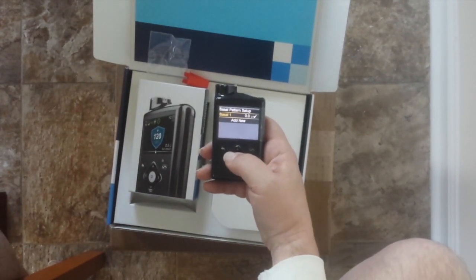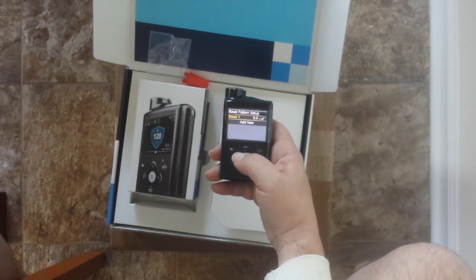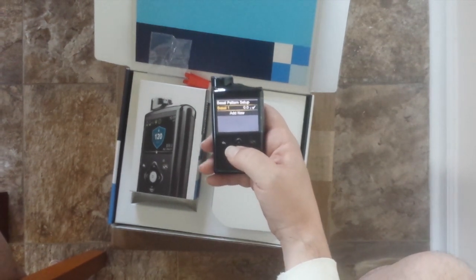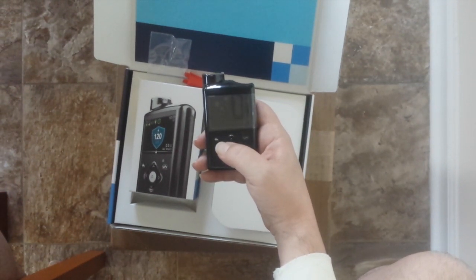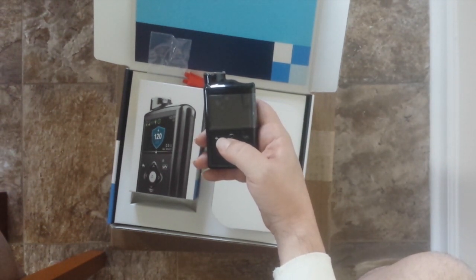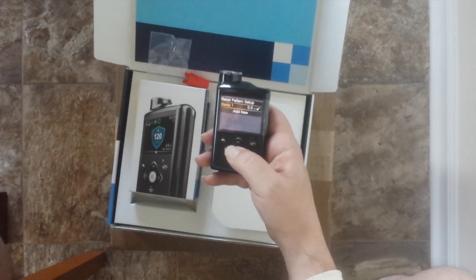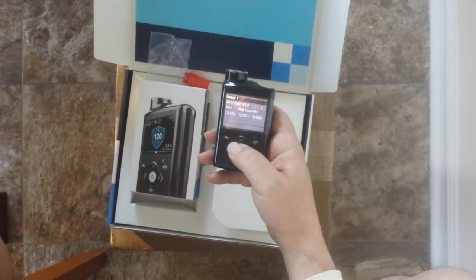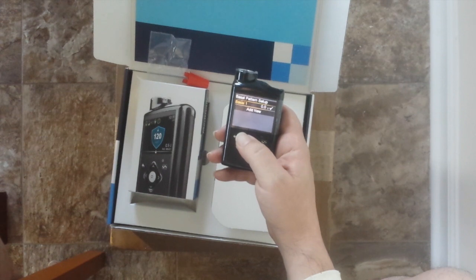This one is very important because it's what you're setting up throughout the day for your different times of the day. Basal pattern one — basically from midnight to 7:30 is 1.2. Let me set this up.